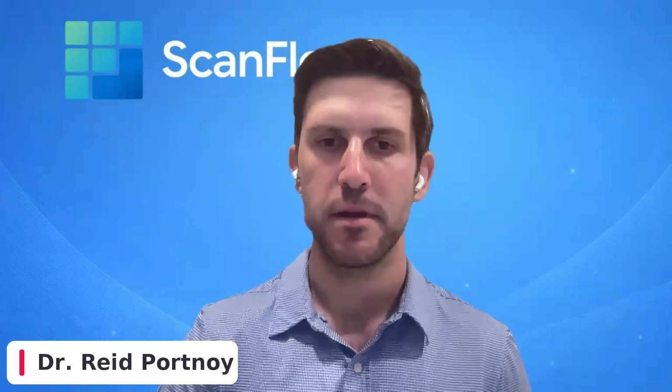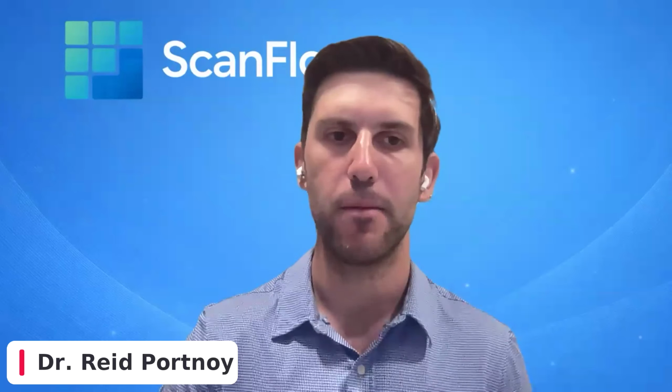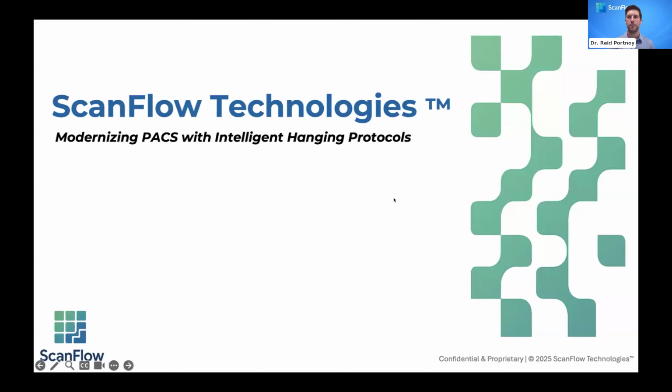Thank you for the introduction, Renata and Marius. I'm going to pull up the PowerPoint presentation. I'm so excited to be able to talk about ScanFlow and our integration with MedDream. We are grateful for the opportunity to discuss how ScanFlow will improve the workflow for radiologists on a per-scan basis.